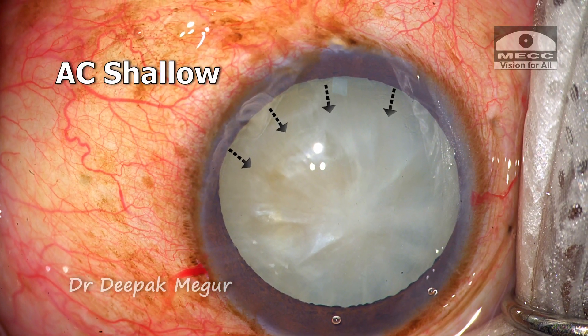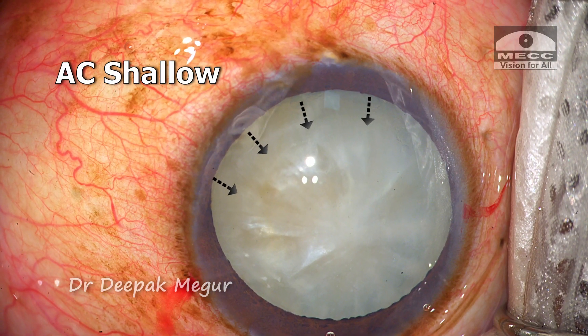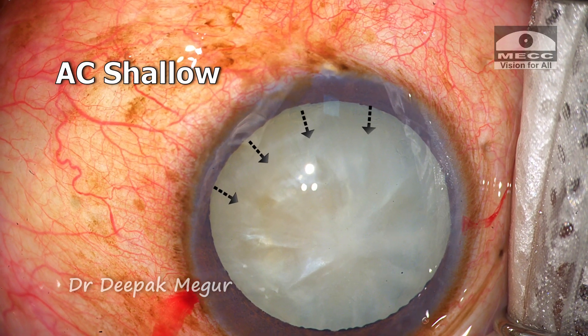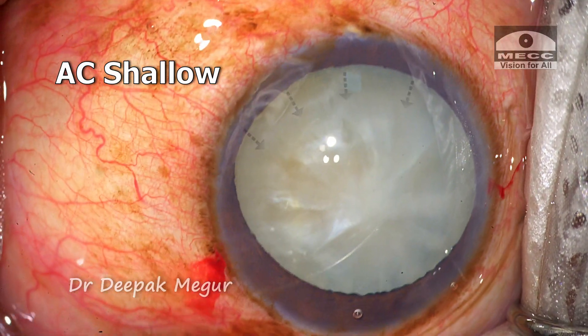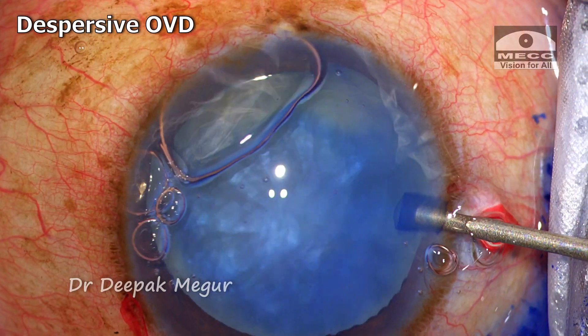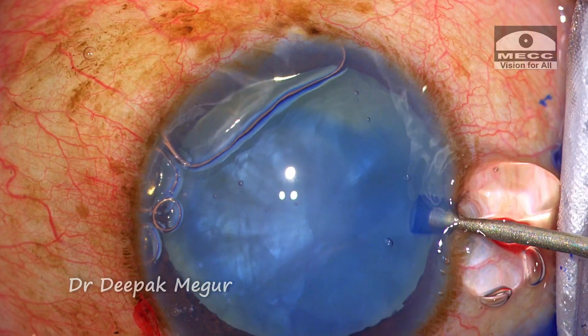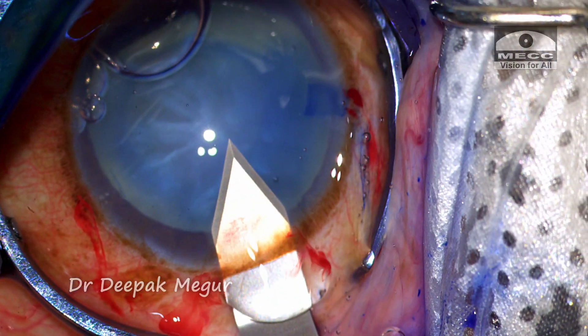Before even putting the dye in, it is very obvious that the anterior chamber is very shallow, especially at this distal end. It appears as if the distal half of the nucleus is slightly tilting up. I fill the anterior chamber with dispersive OVD, deepening the anterior chamber, and the main 2.8 mm incision is created.